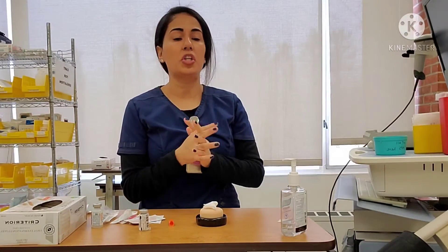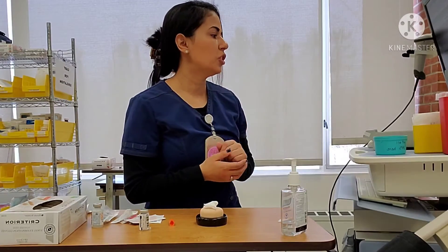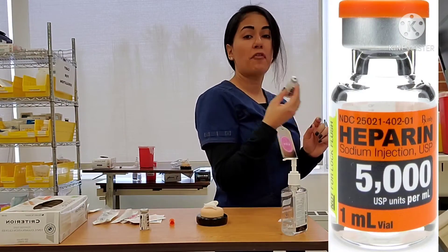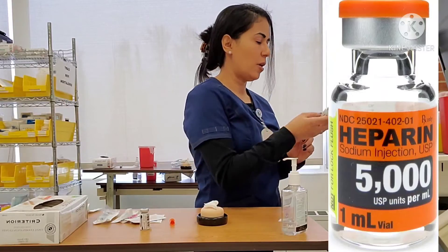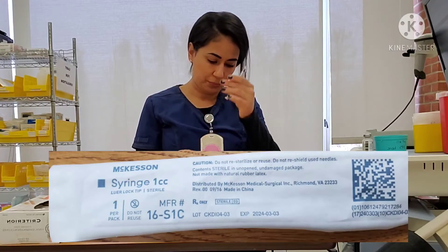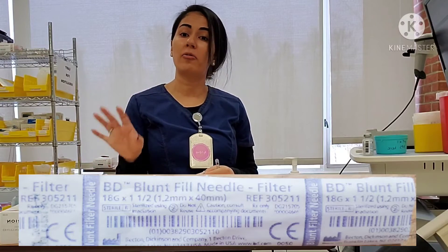This patient is receiving heparin prophylactically to prevent blood clots while immobile in bed. So I'm going to check my order — it says heparin 5,000 units sub-Q. I'm going to grab my heparin; I have a 5,000 unit vial. My concentration is 5,000 units per one milliliter, so I'm going to withdraw one milliliter. Now I'm going to grab my supplies. For this injection, I'm going to use my one milliliter syringe. And I am going to use a blunt needle this time.